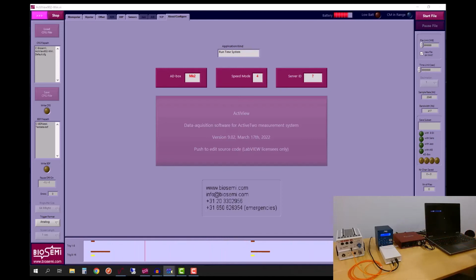Triggy acknowledges that it received it with a code of the same duration on another bit down below. So everything on the 9 through 16 is Triggy's representation of events that it has detected, and so the yellow one is saying, I've acknowledged the bit that's being set above.